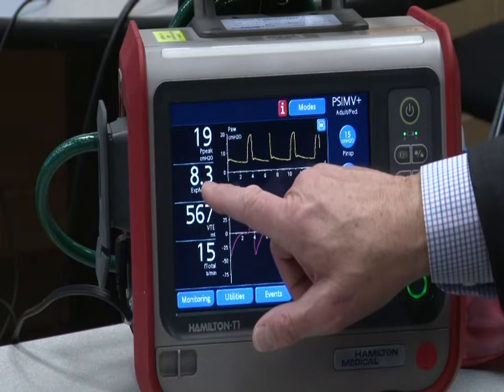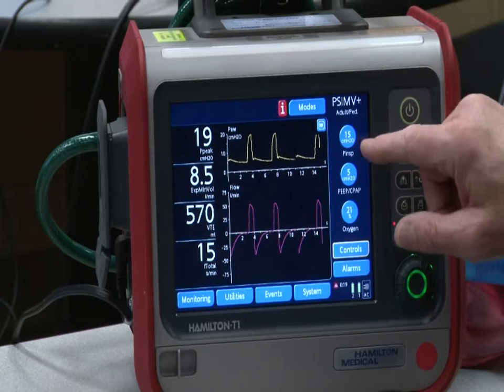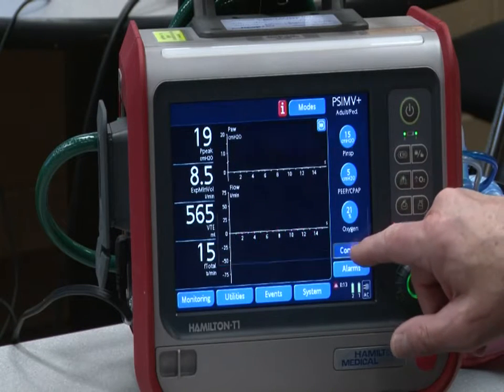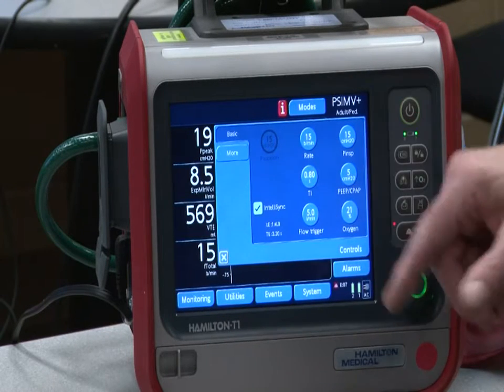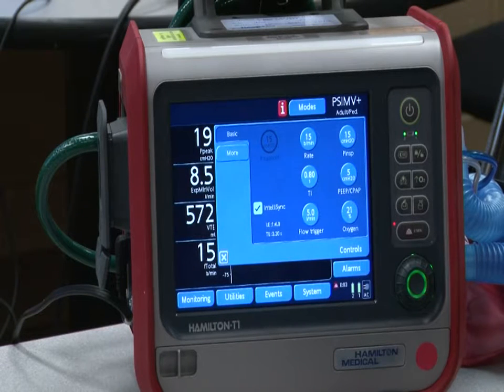So now you have to manage the tidal volume. As comfortable as we were with having ASV do it, we're back to, okay, we have to manage it. So if you turn the pressure control up, you'll get more volume. If you turn it down, you'll get less volume. But you're also adjusting the rate and the I time and all that, just the same as you do today. Again, the reason we're using this is because if the patient's pulling real hard, and that was those patient groups that we wanted to set up on this mode, the patient wouldn't wean off the support from the ventilator. But you're going to have to manage the minute volume and the tidal volume.